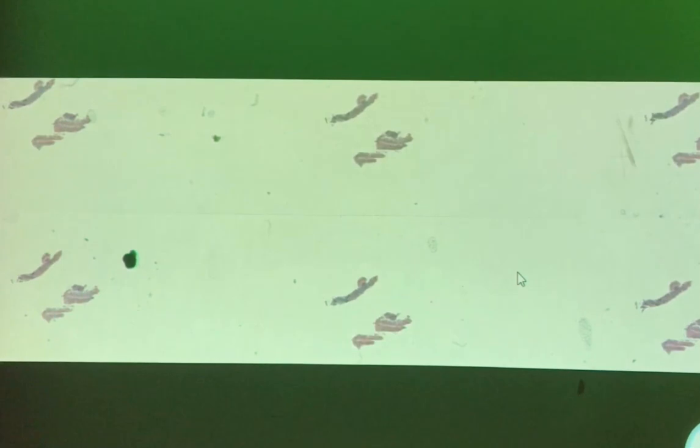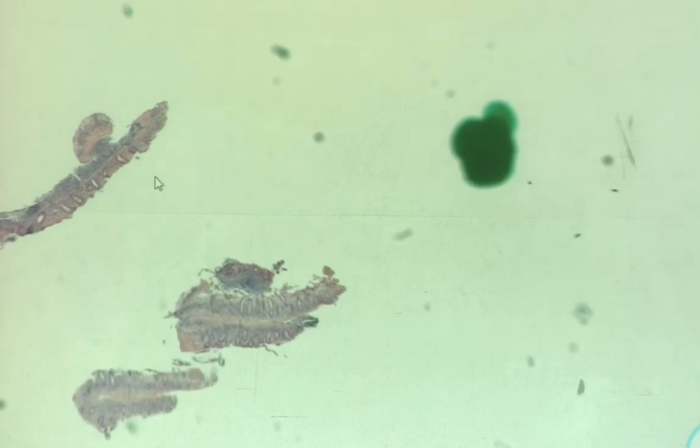So this is case 3. We have a lot of cross sections of the same piece, and what we notice is, hey, someone left us a little love mark. There is an ink spot here, which is fine. There's nothing wrong with that. So we're just going to go in and take a look at this piece.